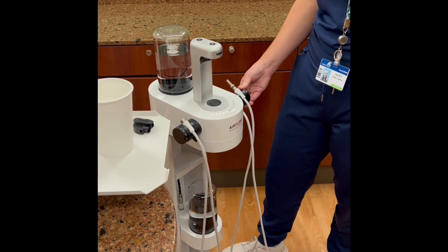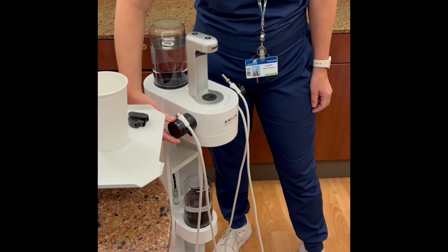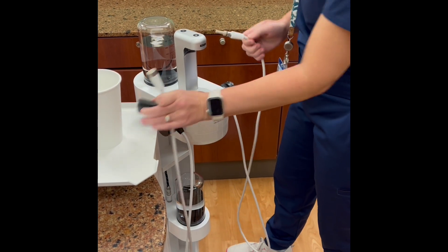Turn water up to the highest setting of 10 by turning the dials on each side of the unit. Remove both hoses from the unit and insert them into the purging cap.